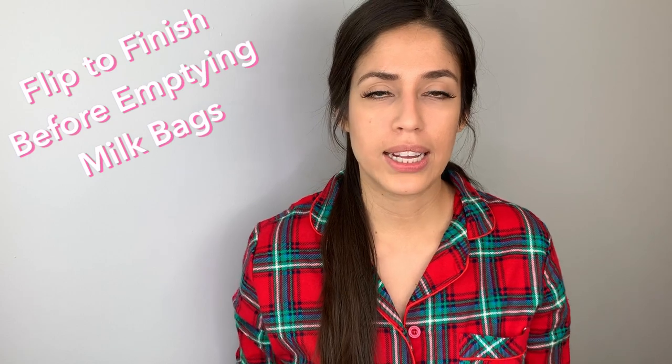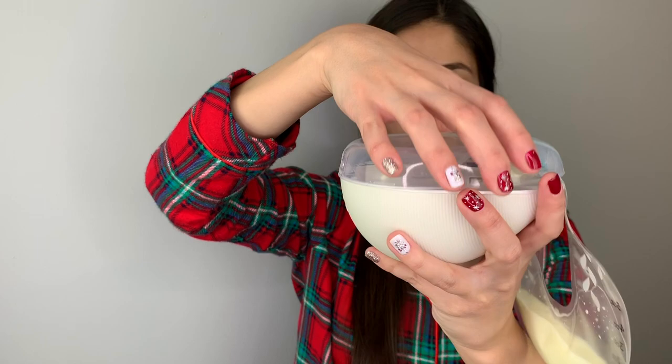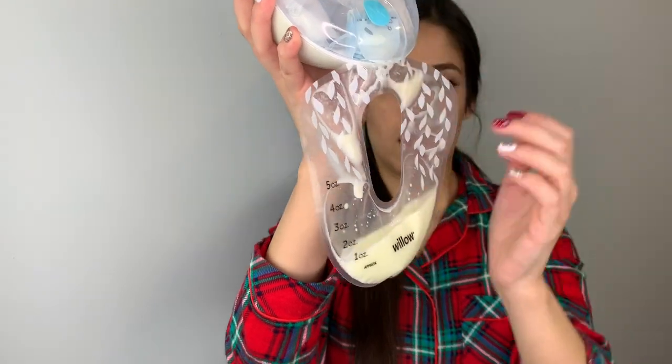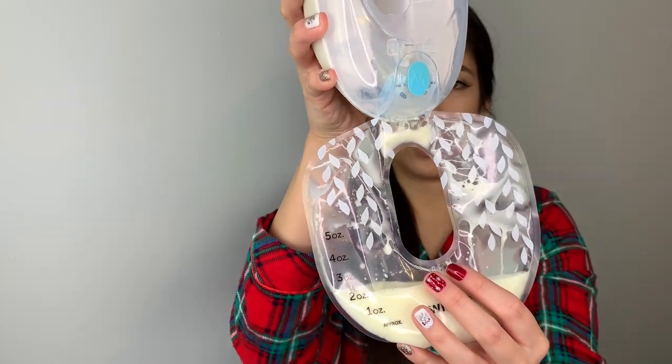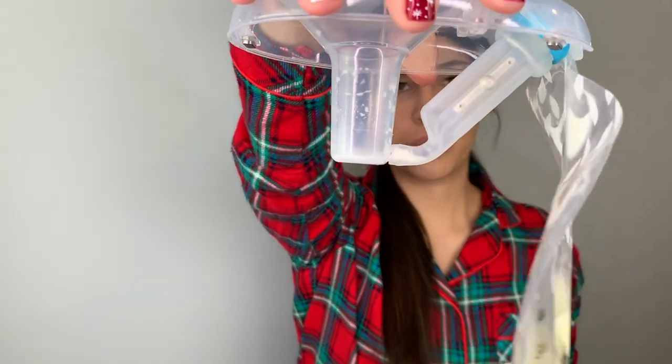Let me show what I mean about seeing the milk. Once you do the flip-to-finish — after detaching the pump from your breast and from the pump machine — you'll see milk left on the flange and the flex tube. Once you do the flip-to-finish like this, press the start button and you can see how much milk is inside the bag. Keep turning until there's no more milk left.